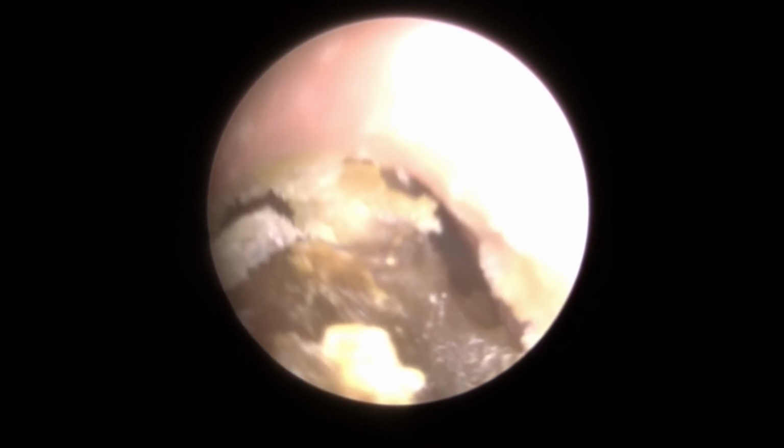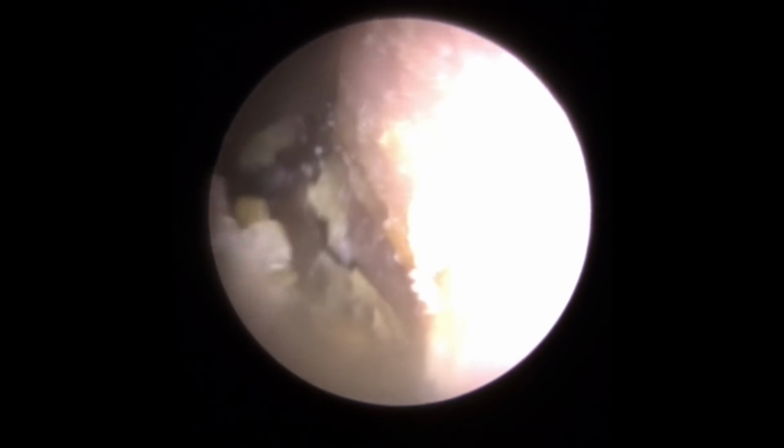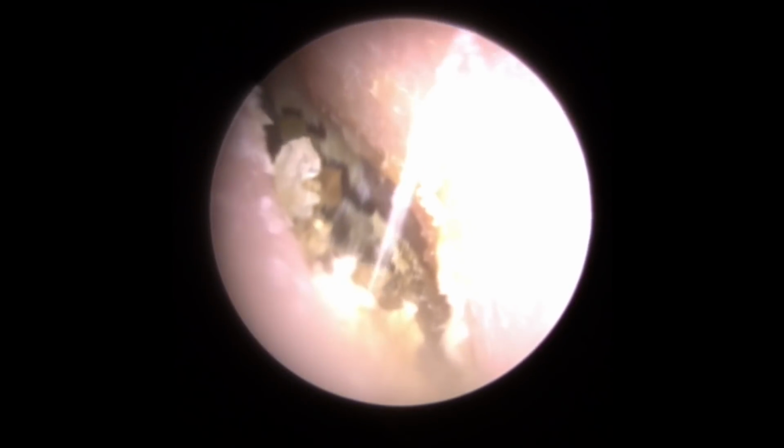So I like to, if I've used a tool and it's broken away lots of little tiny bits, you can see we just got a little gap there to the top right hand corner. I used a little bit of suction just to clear up any looser bits. And we're going in with the Jobson horn. What I'm trying to do here is detach it from the left canal wall. I'm trying to make this wax a little bit looser in the canal, so we've got a better chance of getting this out. That's not really budging very well there, so we're just going to go over the top.